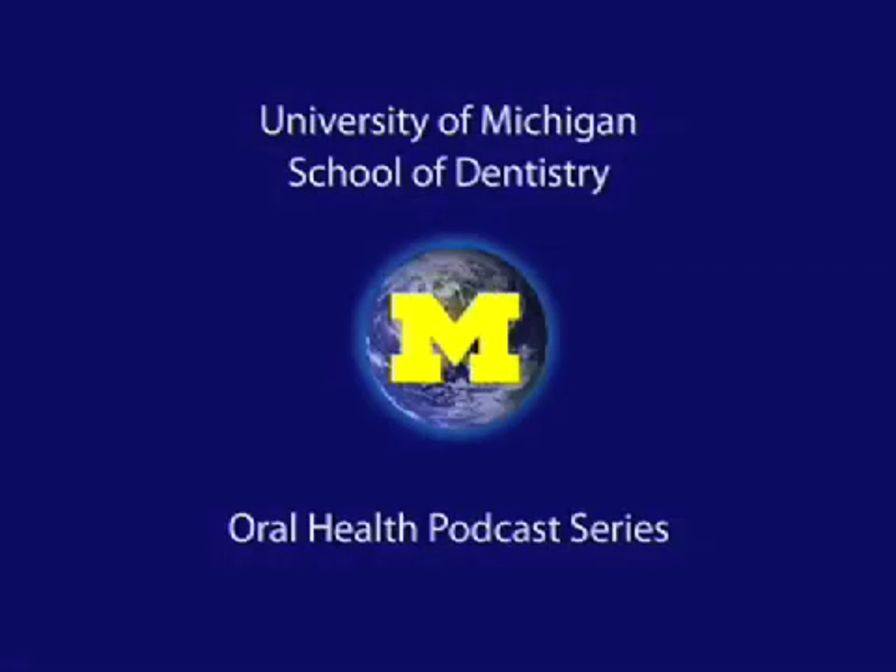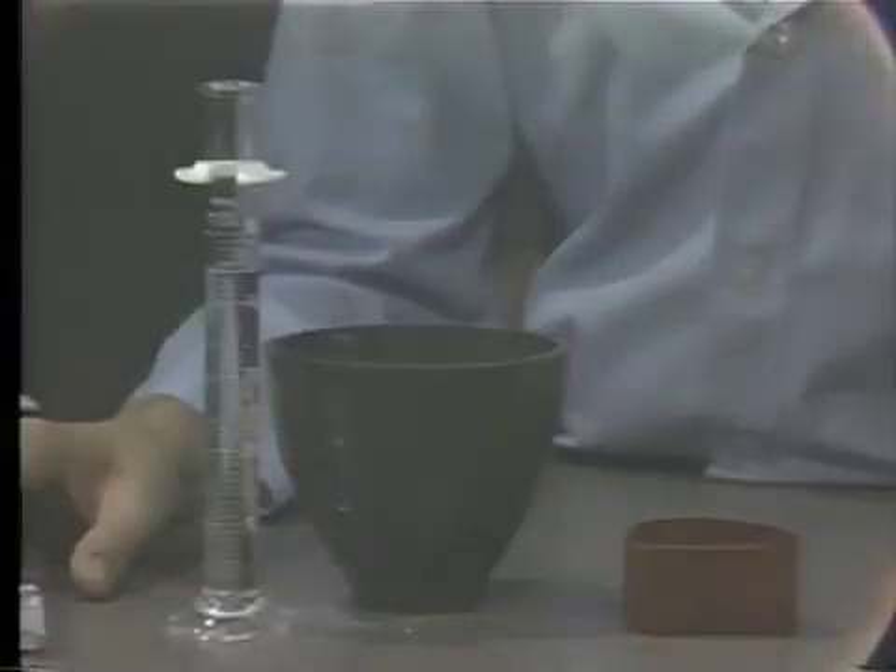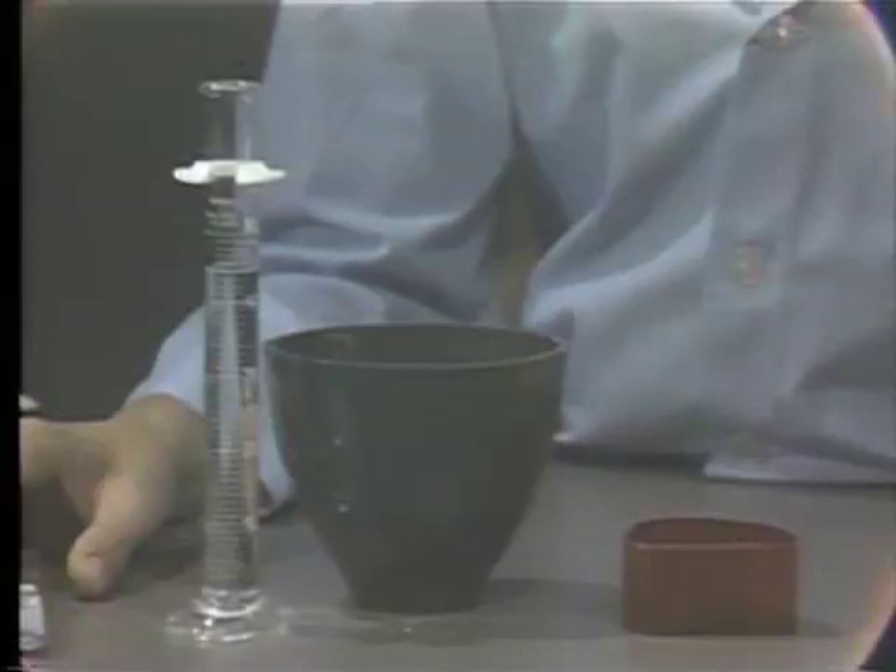Welcome to the University of Michigan Dentistry Podcast Series, promoting oral health care worldwide. After properly boxing the maxillary and mandibular impression, we are prepared to pour the master cast. In complete denture prosthodontics, we will be using the yellow dental stone.